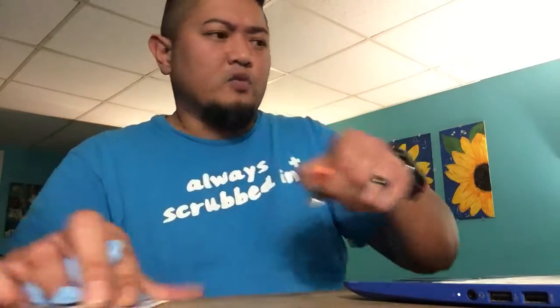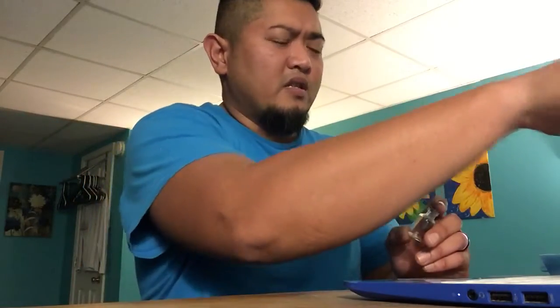After gathering all these supplies, we're going to move towards the patient's room, just right outside, to do our second med check, checking our 6 rights. Again, the patient's name is Diabetes, date of birth is 12/12/50, aspart insulin, sliding scale. Again, the patient's blood glucose level is 128. That's between 100 and 150. It says here, per sliding scale, the patient is going to be given 4 units of insulin. Route is subcutaneous, and it needs to be given at 12 o'clock, which is right about now.